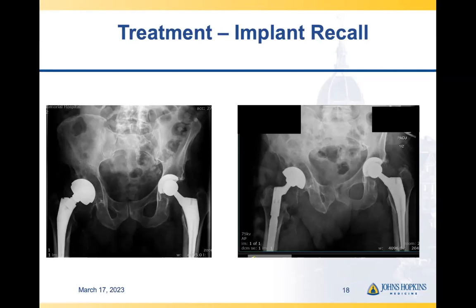The pathologist evaluates it. In many situations, the patients decide to pursue legal options to understand why the implant failed and to discuss that with the companies that designed it. So we like to keep these implants with the pathologist for further retrieval if need be. In this situation, the patient ended up with a very successful revision surgery. Again, the socket part was well fixed and did not need to be disturbed, and we only changed the part in the thigh bone.